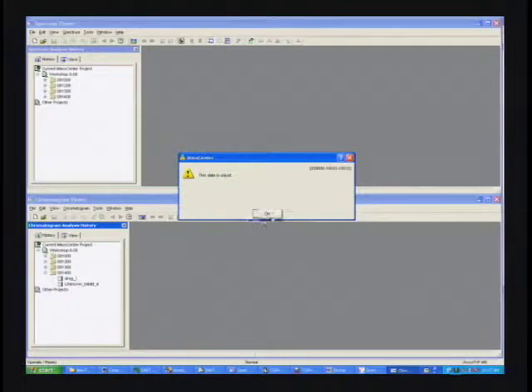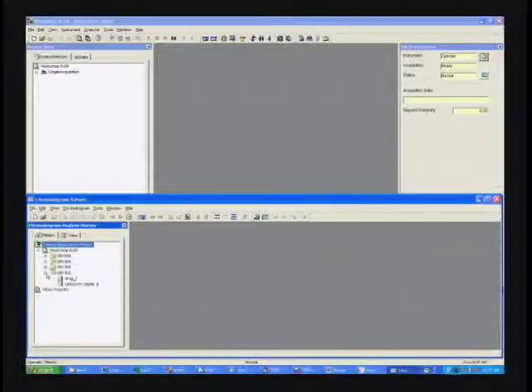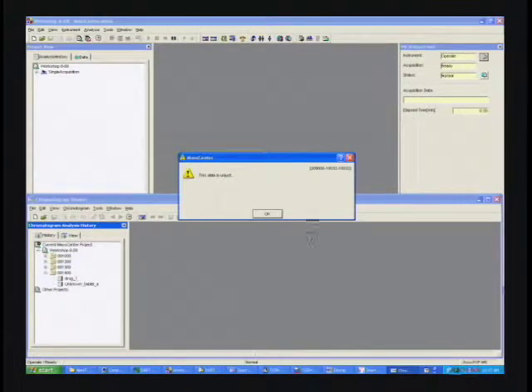And it says the data is unjust. And that's real trouble. This is stopped. Bear with me just a moment. All right. We're going to have to stop for a second, gentlemen.